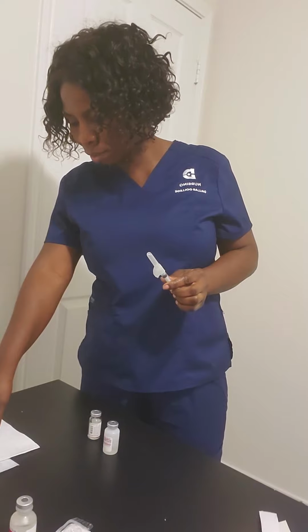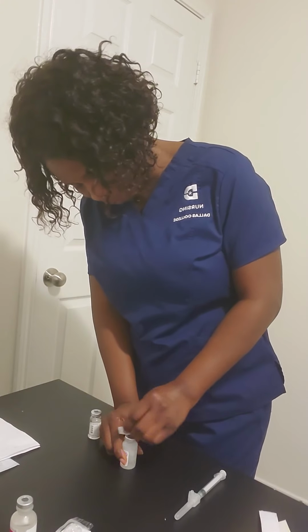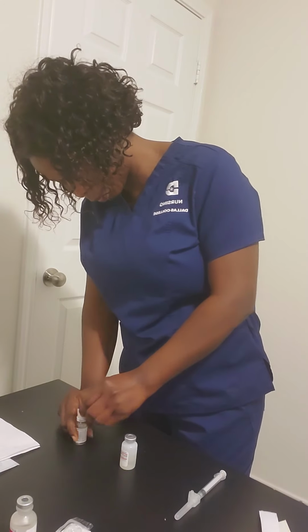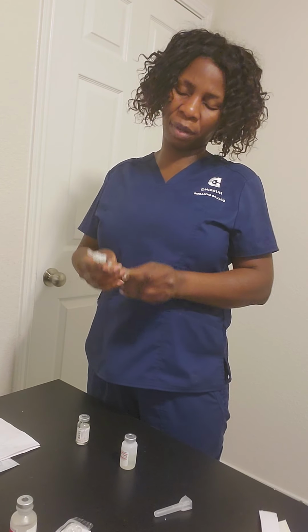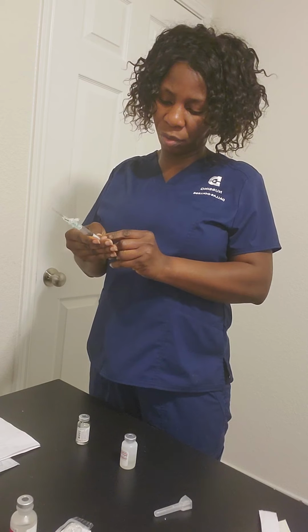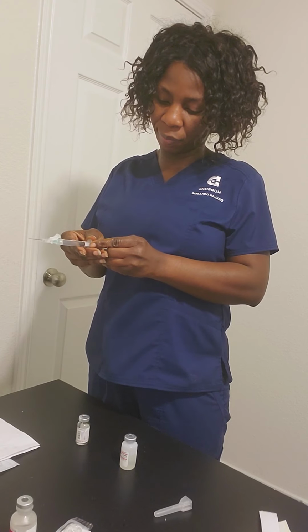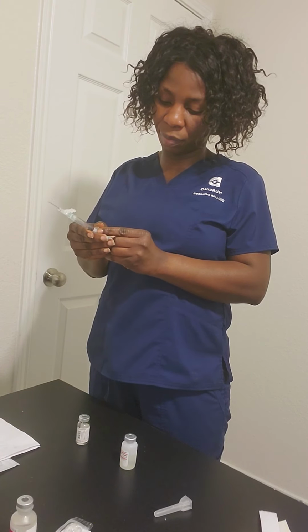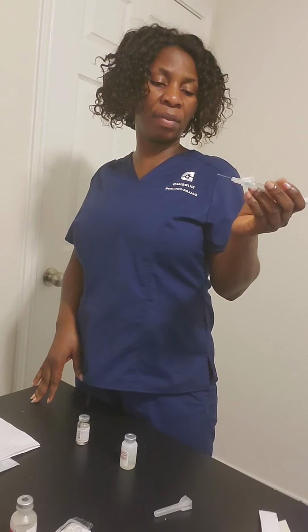So it says reconstitute in 2.5 ml sterile water. I'm going to put this on the counter, get an alcohol pad, and wipe the cap of the vial. Now wipe this one too. So down, I'm going to take off the cap. The needle should always go this way, and I'm going to draw 2.5 ml of air into the syringe. So I've been able to draw 2.5 ml of air.